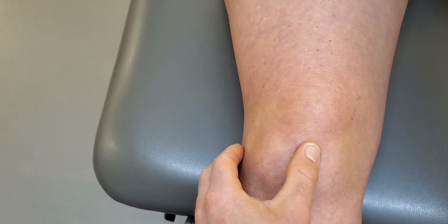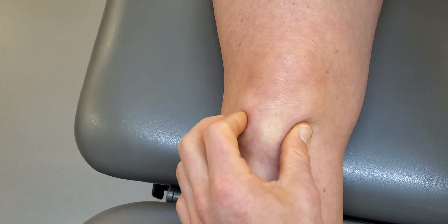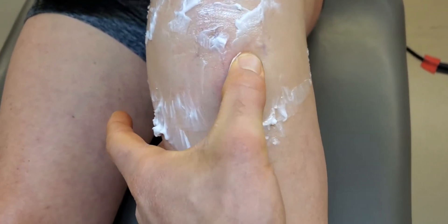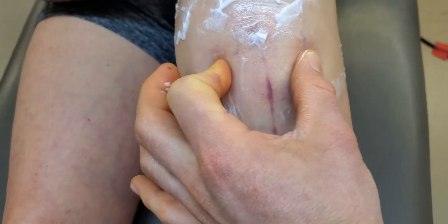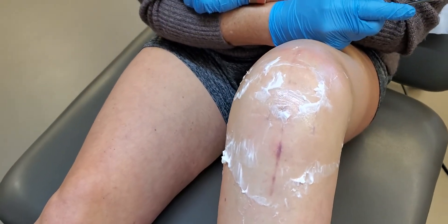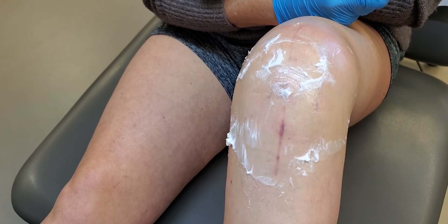Additionally, what we should see is that the tissue down here — your infrapatella fat pad as well as the patella tendon — can wiggle and move and is pliable. Versus when we come to the affected side, we notice there's not as much. That is your qualitative self-assessment done over time, and that will be your return on investment of incorporating this, as well as promoting normal patellofemoral mechanics.